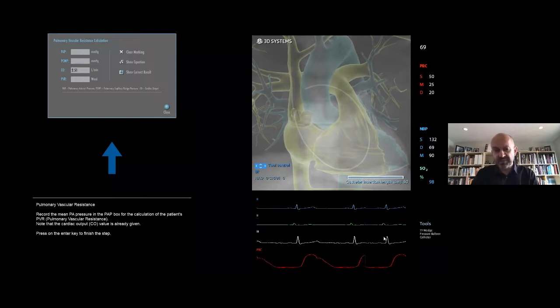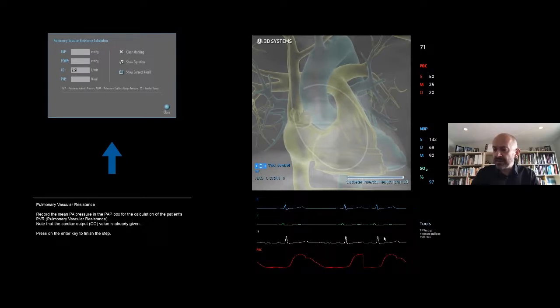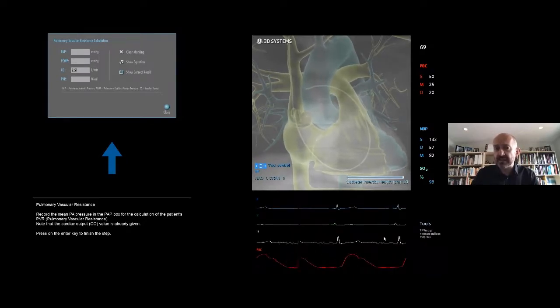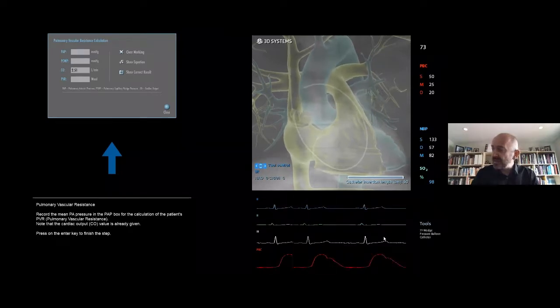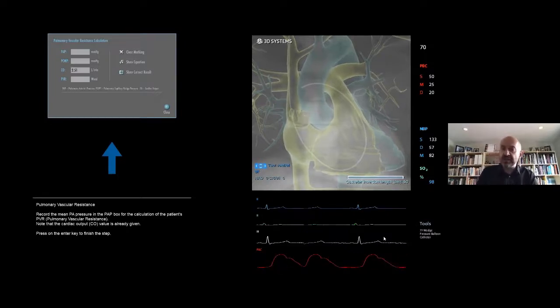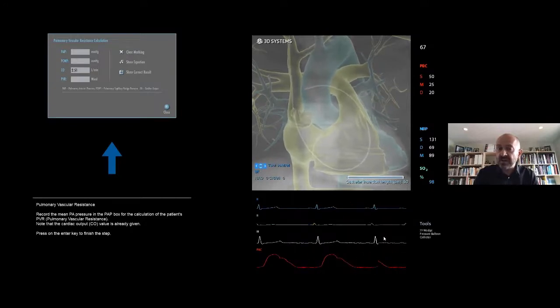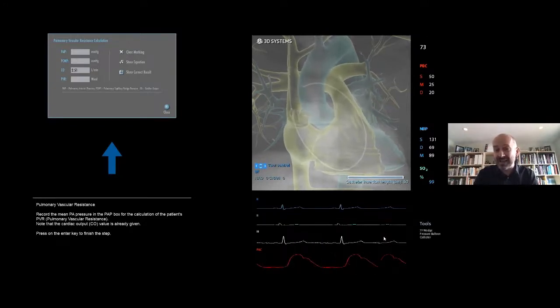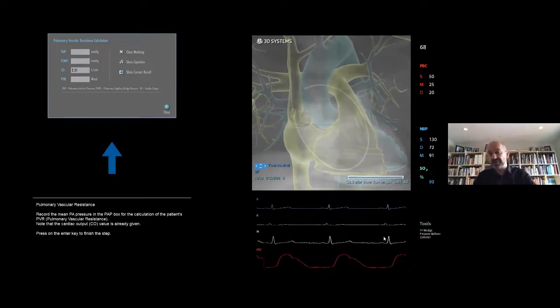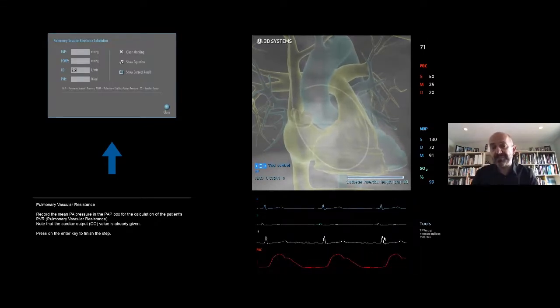From the pulmonary perspective, the classic traditional use of the PA catheter is to determine whether a patient has pulmonary hypertension and what is the cause of this pulmonary hypertension. And for that, you do need to see what your wedge pressure is. So if the wedge pressure is low, but the PA pressure is high, that would generally suggest a pulmonary process, versus if the wedge pressure is high and the PA pressure is high, that would generally suggest a cardiac problem.